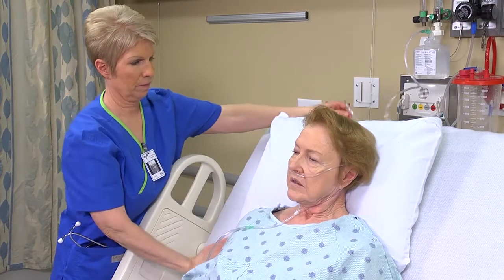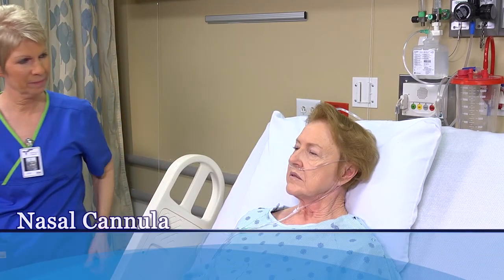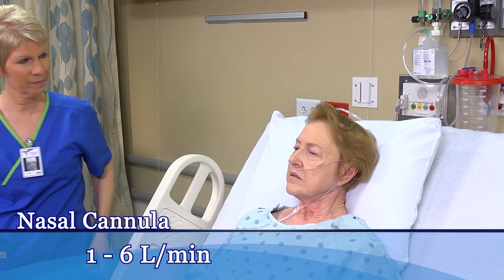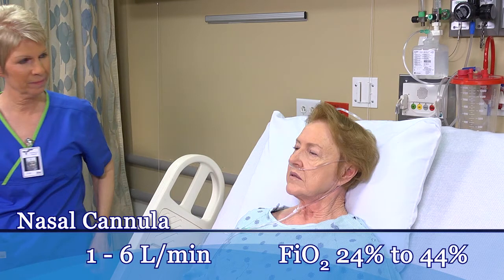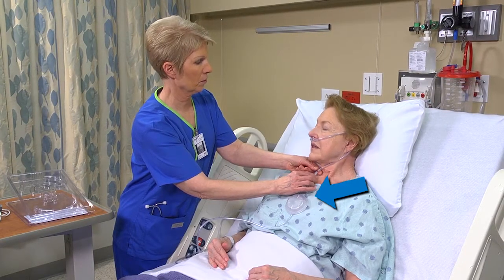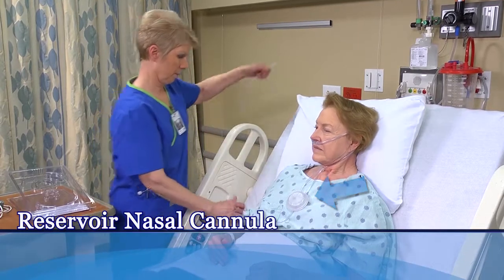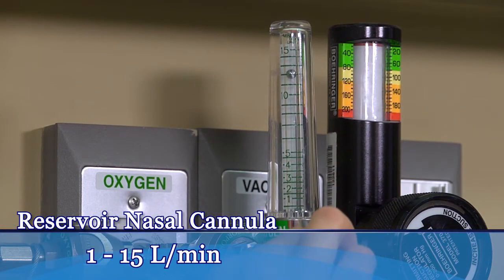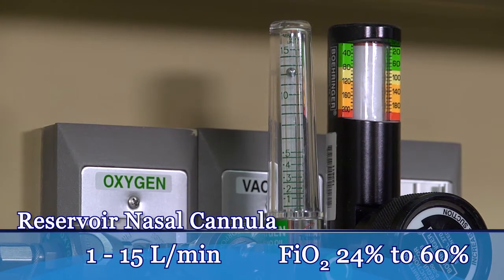A patient with a nasal cannula will require a flow of 1 to 6 liters per minute, delivering a fraction of inspired oxygen, or FiO2, of 24 to 44 percent. A patient with a reservoir nasal cannula or oxymizer will require a flow of 1 to 15 liters per minute, which supplies an FiO2 of 24 to 60 percent.